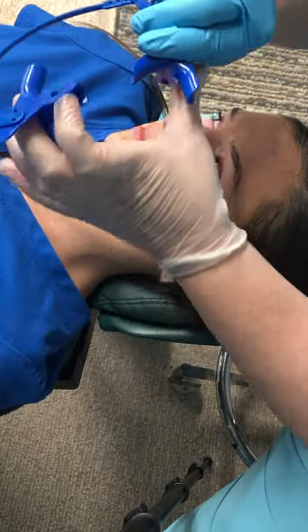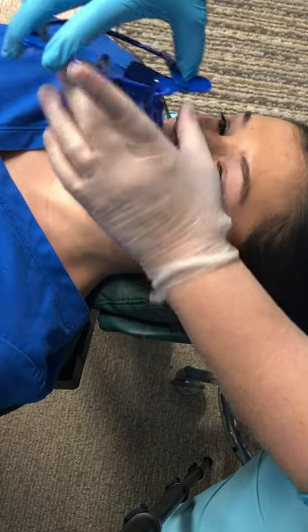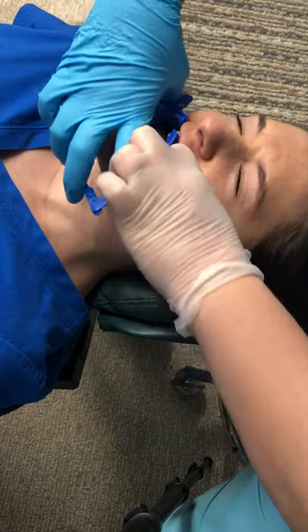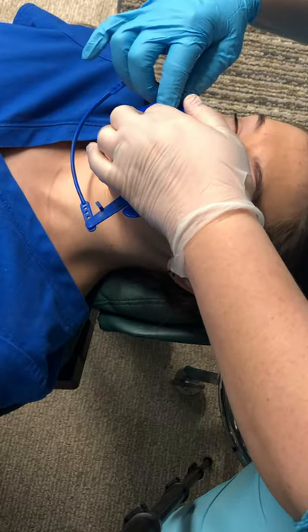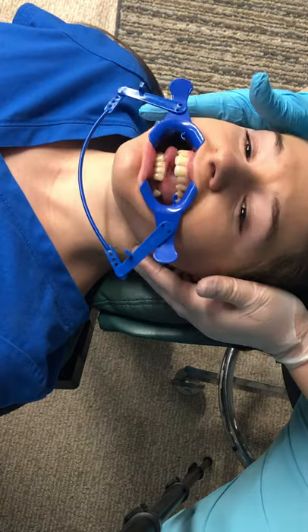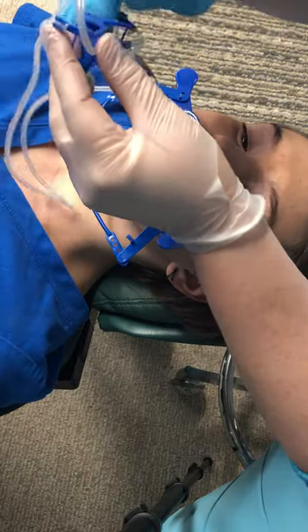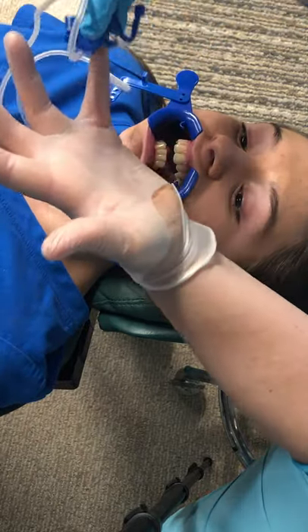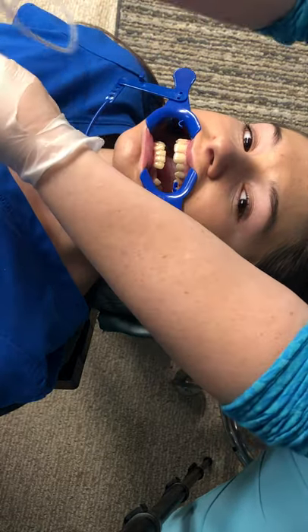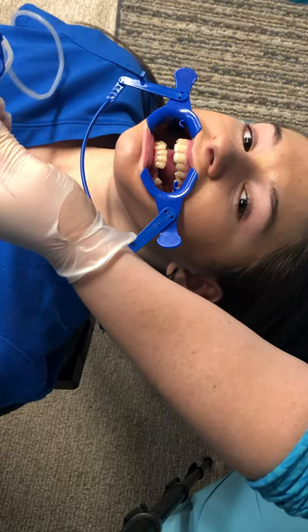We're going to put these cheek retractors in. The purpose of this is to keep the lips off the teeth. Tip the chin up a little bit. Now, this is your tongue guard — your tongue fits in it just like that. These little side pieces connect into the cheek retractors.